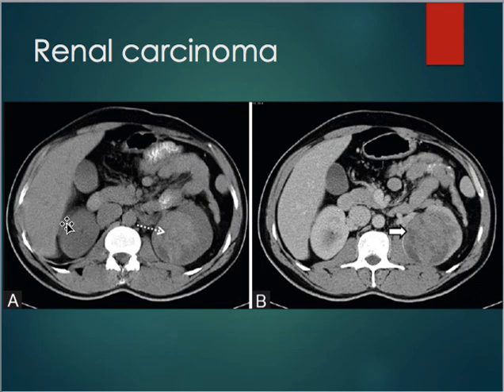Here is actually a renal carcinoma. So you've got normal kidney over here on the right, and then the left one, that mass has completely taken over the kidney and you can't even see clear definition of it anymore. Again, over here too. But this is cancerous.